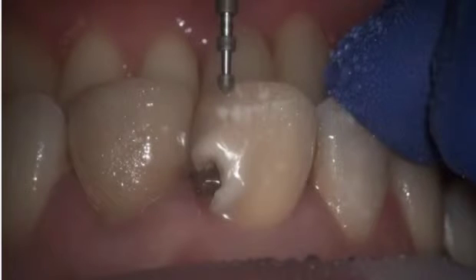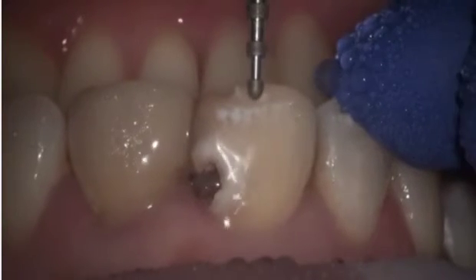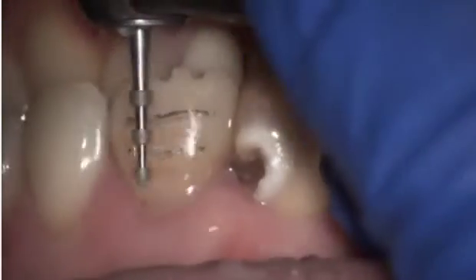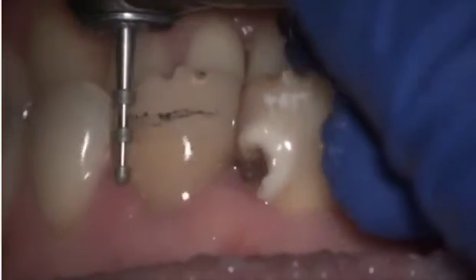And again, even in a case where we need endodontic treatment, I'm starting with prep to be able to know the information about the restorability of the tooth before I will start endo. This is the marking preparation. This is a 1 mm cut of the incisal margin and the marking lines on the vestibular side.